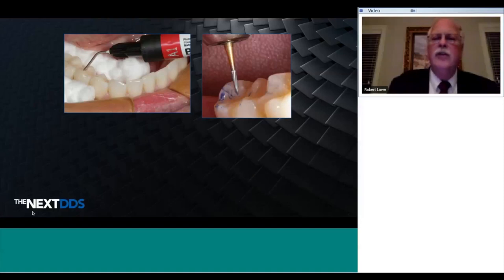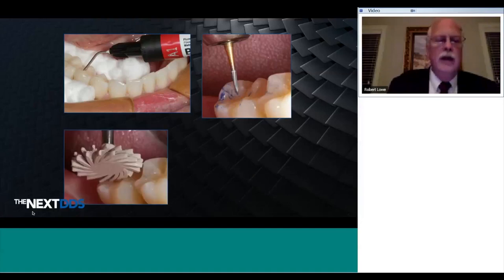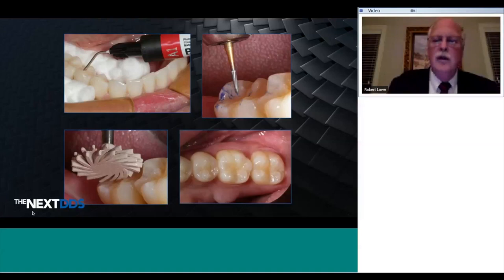Checking occlusion and making adjustments with the 12 fluted and 20 fluted burr, and then using rubber polishing armamentarium to polish deep into the grooves. We find restored teeth here that, if you just look at that picture, I think it would be hard to find the restorative material. Yet decay has been detected in its earliest forms. The preparation has been minimalistic, conserving healthy tooth structure, and the restoration has been made with a bioactive material to help protect and preserve the integrity of the dentition.